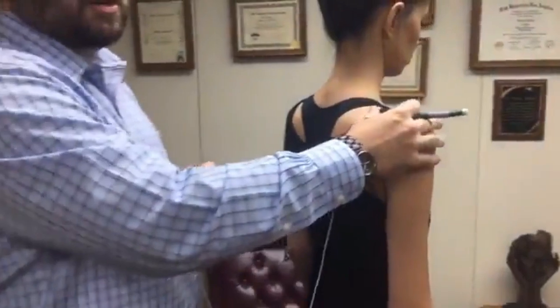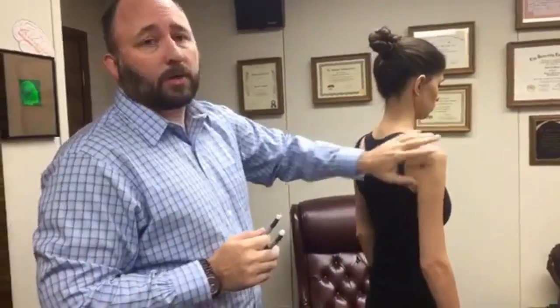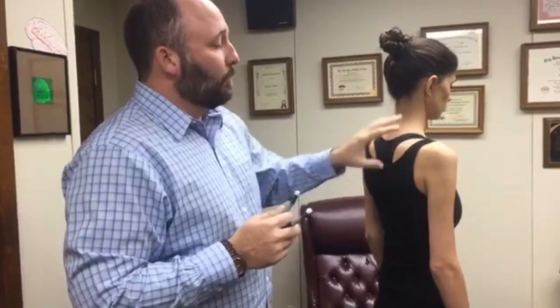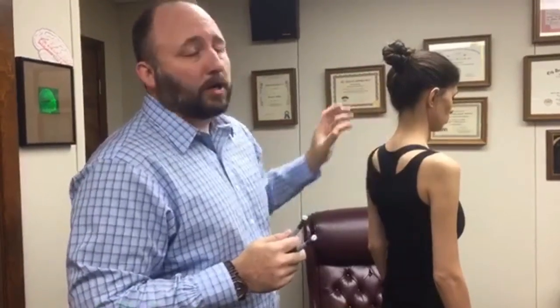Focusing on that one location lets the current radiate through it at different angles as we treat. You do that for about six locations, which is another minute — so now you've done about three minutes of treatment on that right shoulder. By that point, usually they're down to a zero, one, or two. We would then use the ear clips with Rachel — that helps bring the peripheral, the spine, and the brain into it, so you've got all three components of your nervous system.